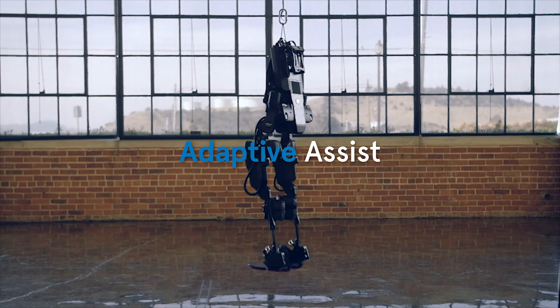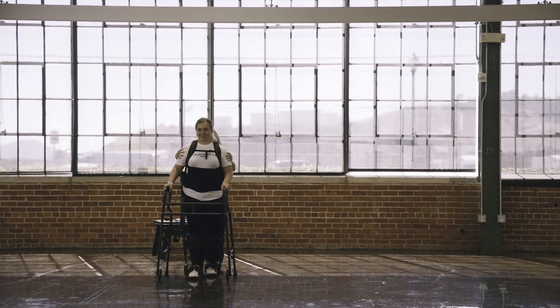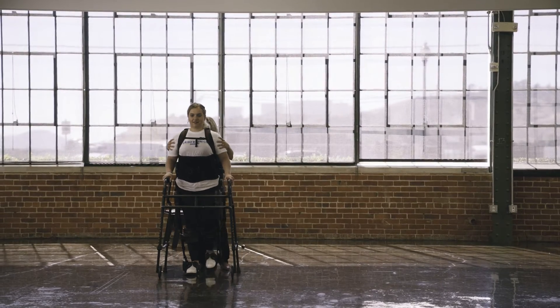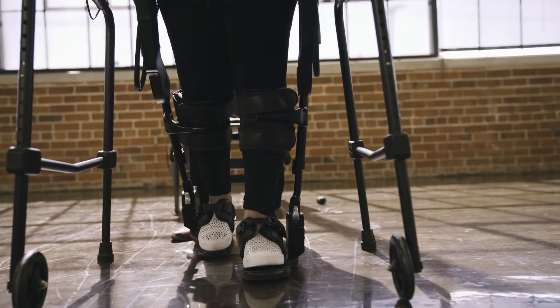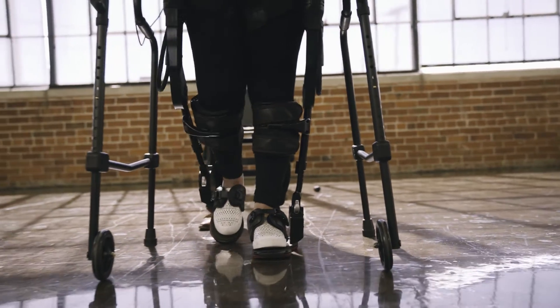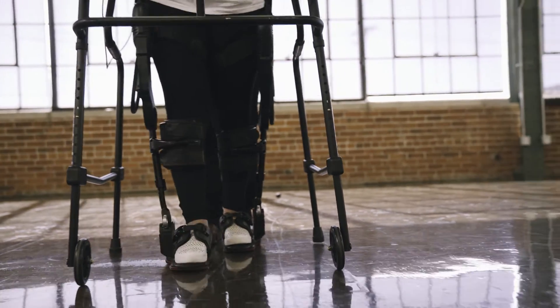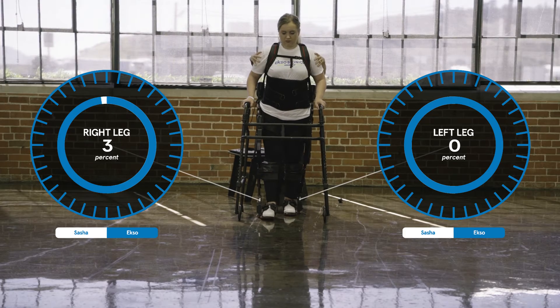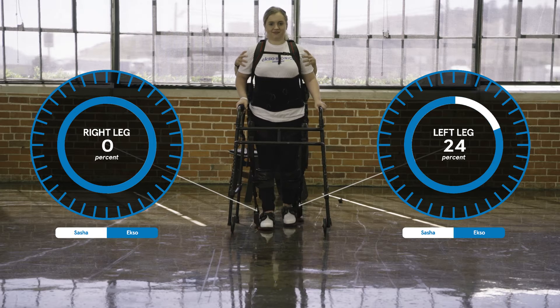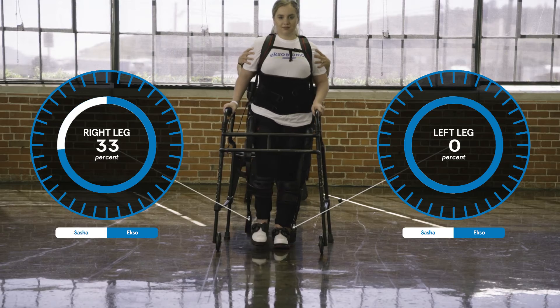Generally, bilateral adaptive assist is a starting point with most patients. This mode allows the patient to feel the gait path or trajectory that EXO is trying to keep them on. It also forces the patient into a symmetrical gait pattern and allows them to take smooth, repetitive steps. EXO-GT will adjust the amount of assistance it provides as needed. The device will assist less if it senses the patient is doing more; if the patient is doing less, the device will assist more to create smooth, normal steps.